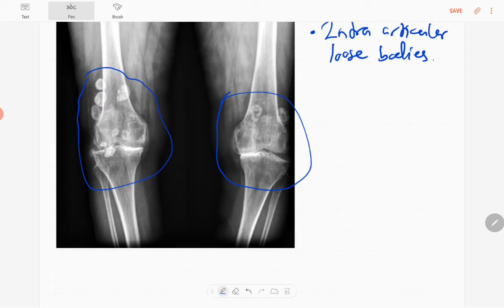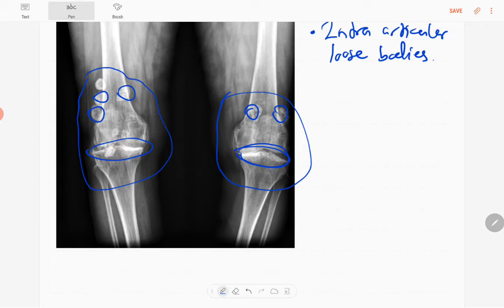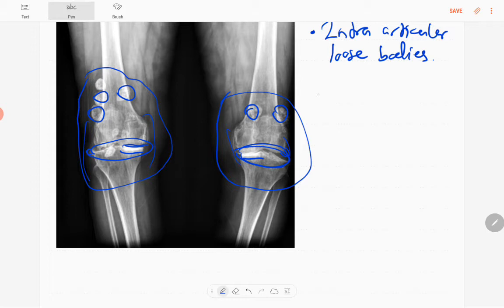In addition to those loose bodies, there is narrowing of the joint space. You can see intraarticular loose bodies with associated narrowing of the joint space, subchondral sclerosis — the medial joint space is more pronouncedly narrowed — and a few osteophyte formations. No soft tissue swelling, no lytic lesions in the visualized bones, no fractures, and no dislocation of the knee joint. This is osteoarthritis.